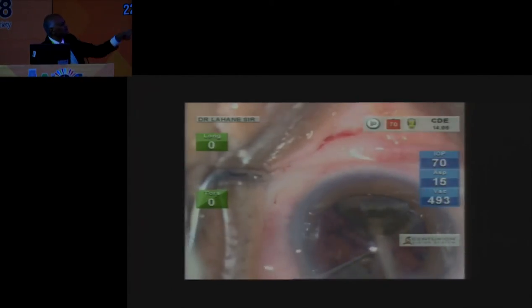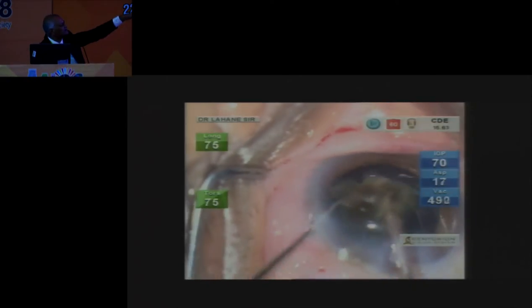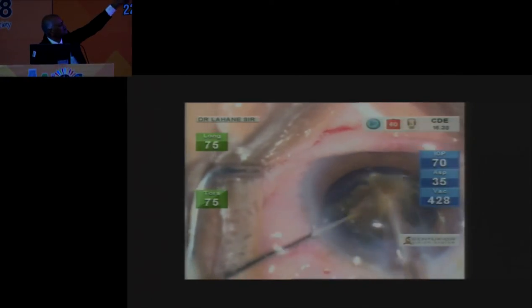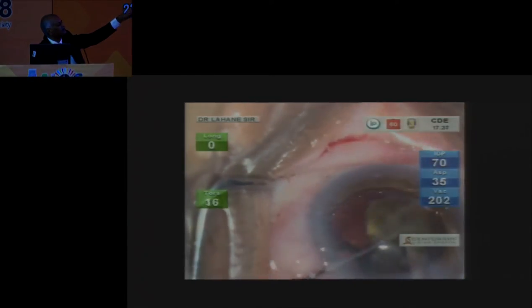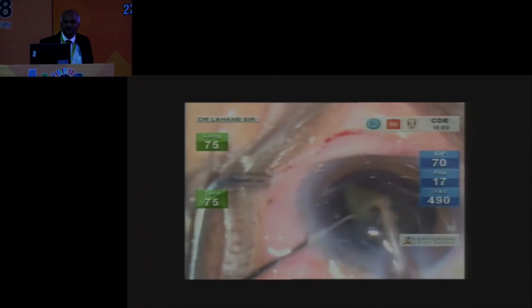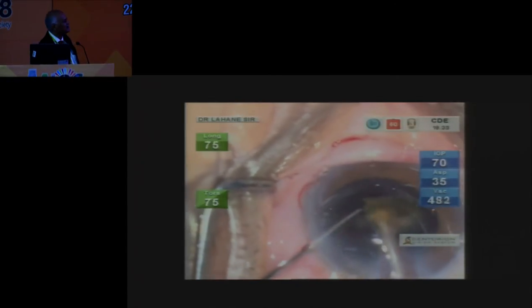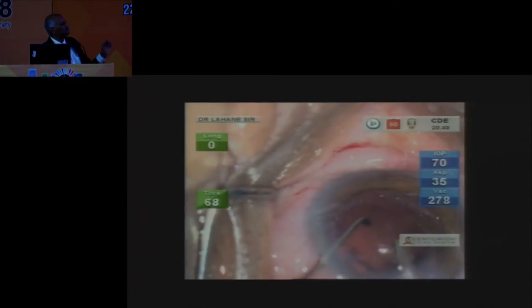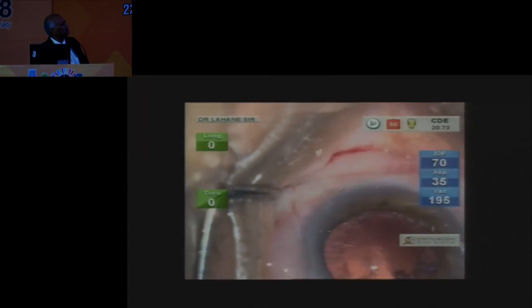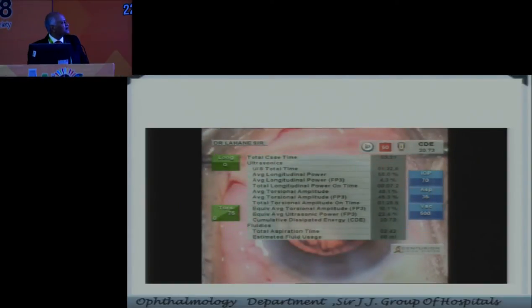Now see again how that is entering inside the hard cataract. Here you can see whenever it is entering, the longitudinal Phaco is working and torsional Phaco is working, and because of that I am doing cutting, occlusion and aspiration. So that is what is there, and in the hard nucleus you can remove such type of nucleus in the IP Phaco.